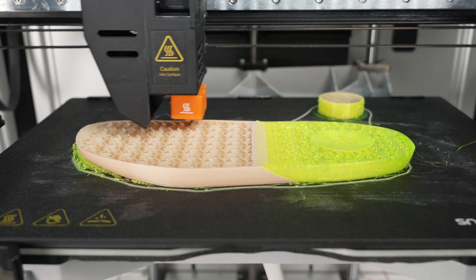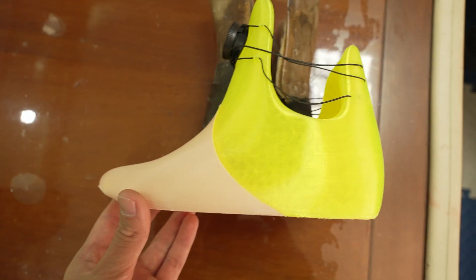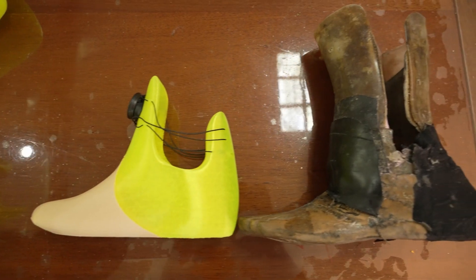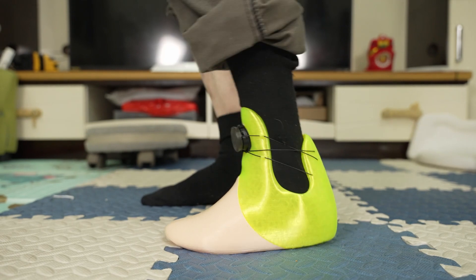Now Owen tries printing out a different inner structure, with different density and different materials. Let's call this one V1. It looks good — it's a little smaller and much lighter, and putting it on goes a lot smoother. Walking with V1 is also improving, and the dad no longer needs to buy a larger shoe.